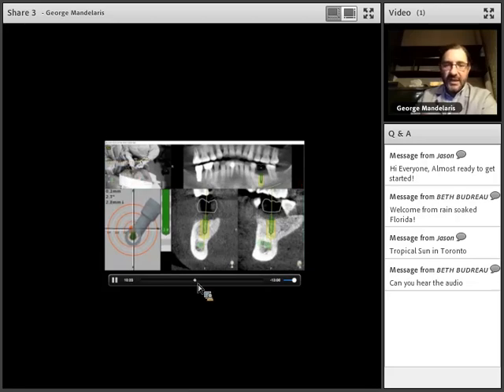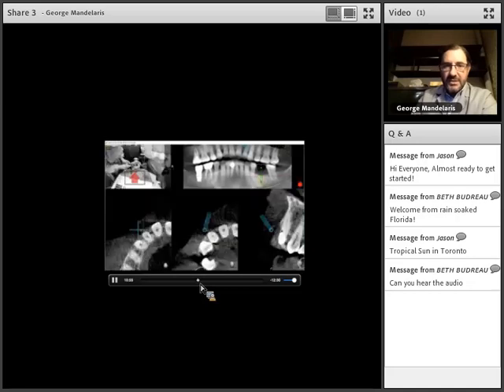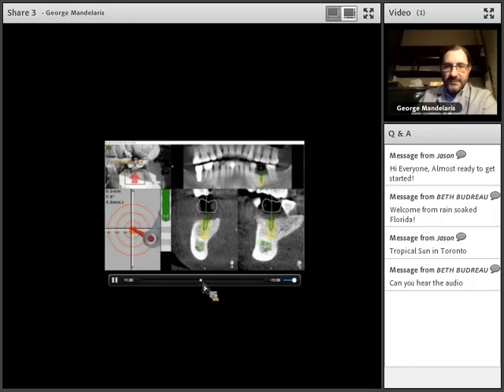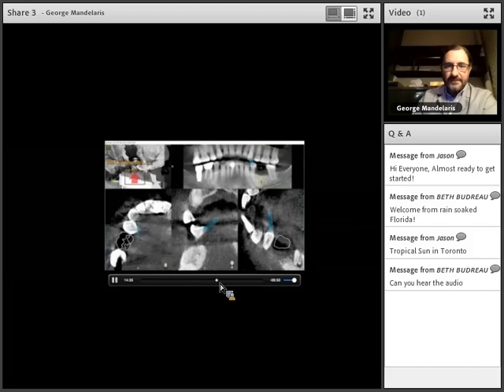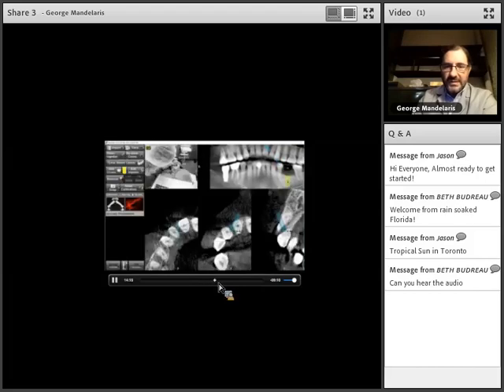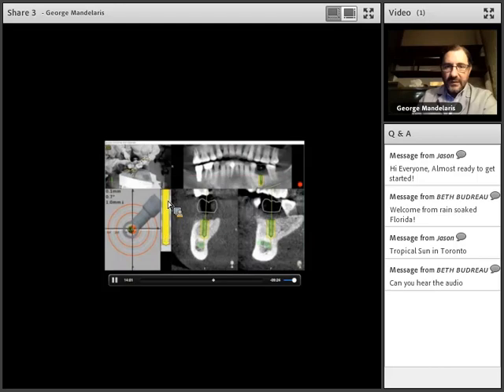At that point, she'll step it up to the next drill, and as you see here, she'll do another accuracy check to make sure that that's correct, and then finish the osteotomy site preparation. And this just continues until the osteotomy site preparation is done. And the nice thing about this too is that as you finish the osteotomy site, you see how things turn from green to yellow as you're getting a little closer, and then it'll start to be red here when you've exceeded your planned depth.